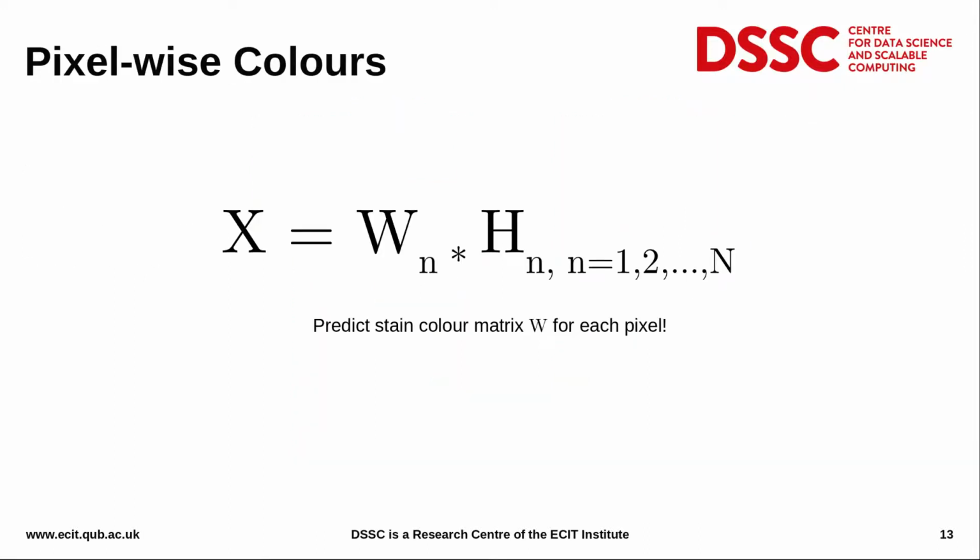As mentioned, in contrast to existing methods, we model the input images X with pixel-wise concentrations and pixel-wise colors, as opposed to pixel-wise concentrations and image-wise colors.